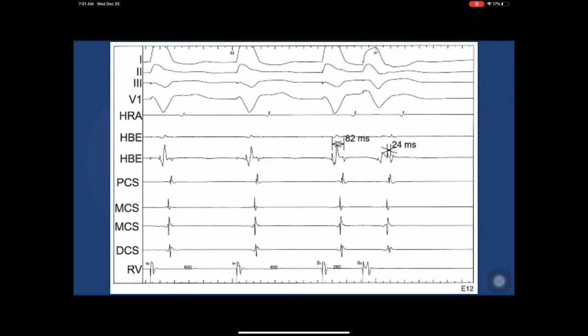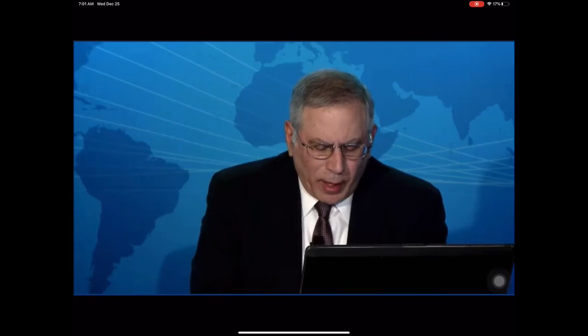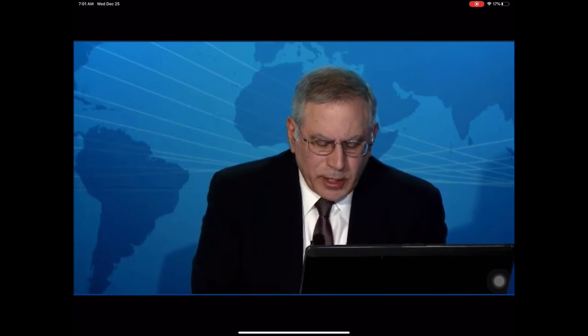That's an excellent question. So we do have another question, and it really is more of a question about my experience, not so much one of the tracings. Someone wanted to know how commonly it is that you see a left atrial slow pathway connection. I think that's another terrific question. Let's take a moment to discuss the history of this.